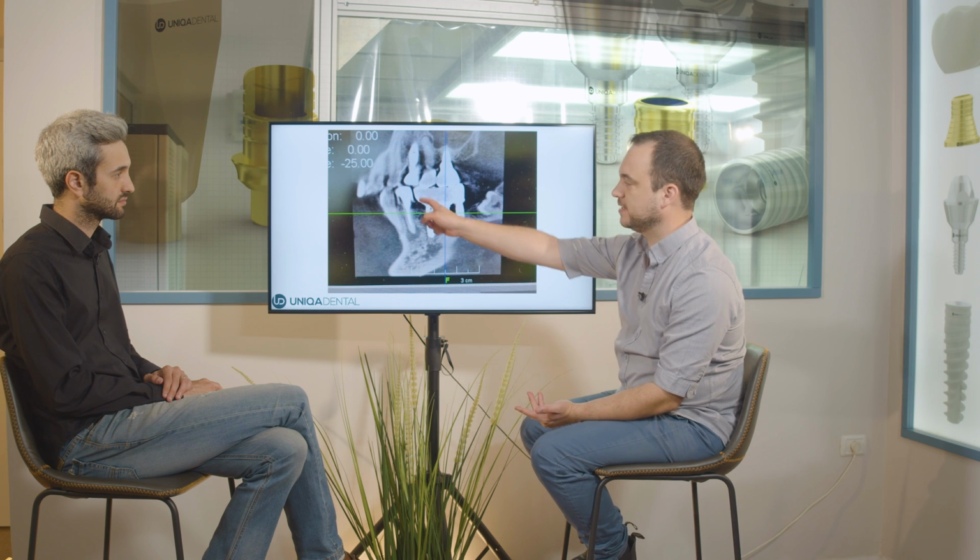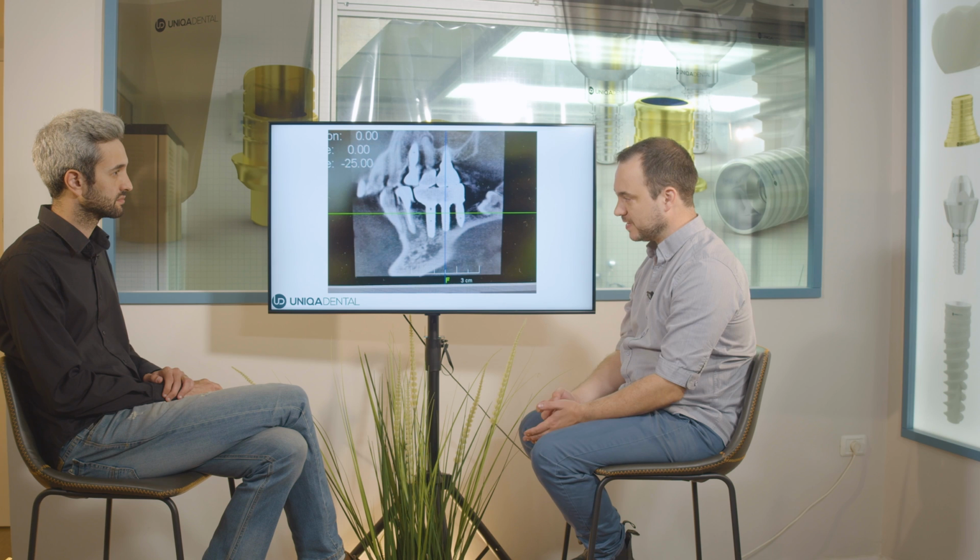On the one hand, we can place and add another implant and we can make a crown on a single implant, or we can maybe add a cantilever to this bridge. Or we can place another implant and make a 4-unit bridge on 4 implants. Probably the 4-unit bridge on 4 implants is a little bit too many implants for this bridge. You can have fewer implants. And depending on the type of the bone, you need to see if you can add implants or not. What we see is we have very thin bone and probably there isn't enough space to add another implant.